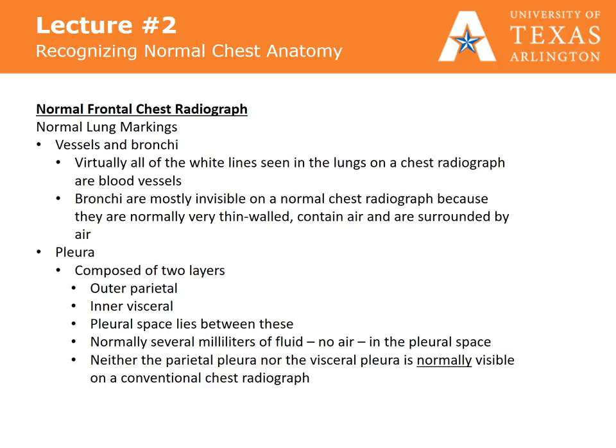Virtually all of the white lines seen in the lungs on a chest radiograph are blood vessels. Bronchi are mostly invisible on a normal chest radiograph because they are normally very thin walled, contain air, and are surrounded by air. The pleura is composed of two layers: the outer parietal and the inner visceral. The pleural space lies between these and normally contains several milliliters of fluid. There is no air in the pleural space. Neither the parietal pleura nor the visceral pleura are normally visible on a conventional chest radiograph.